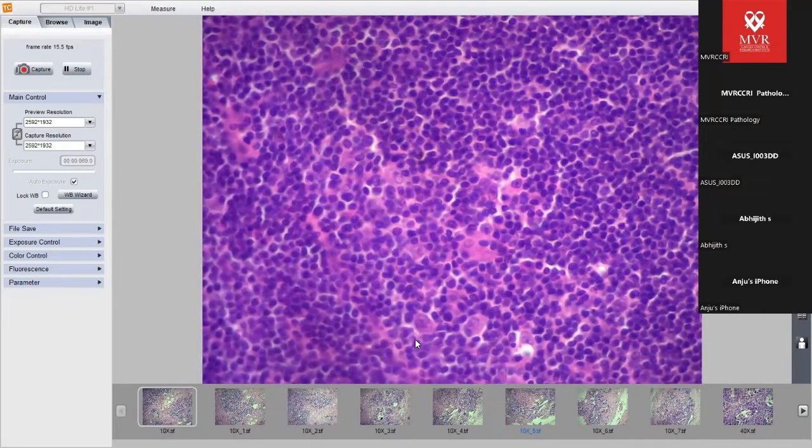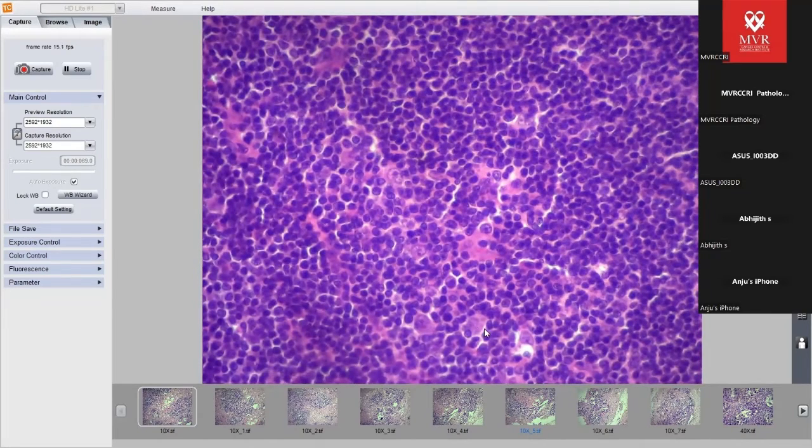Again, on higher power, there are prominent nucleoli, large cells, and the size is very high compared to the background small cells. The background cells don't show any atypia, very nice reactive lymphoid cells. The size of the Hodgkin cells is quite increased compared to that of the background cells. We have the prominent nucleoli. So clinically, we will think about Hodgkin lymphoma here.